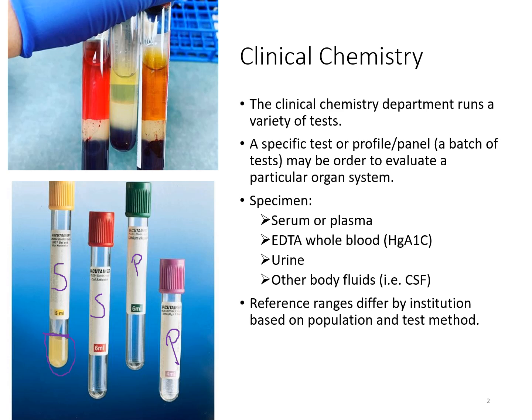The reference ranges will vary per institute, and they're based on the patient population. That facility would run some tests and do some studies to determine the normal reference range for their patient population in that area. I also want to make a note that with chemistry, you do have to pay particular attention to the sample quality.